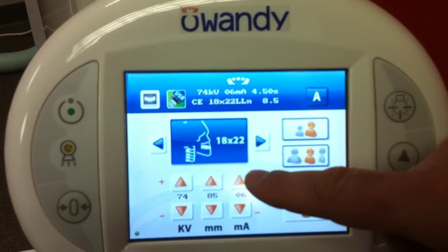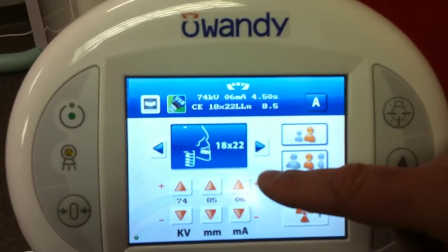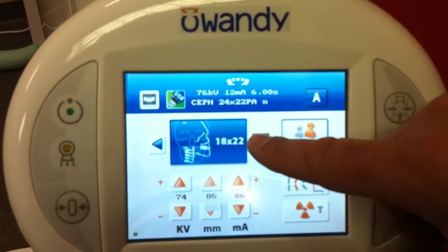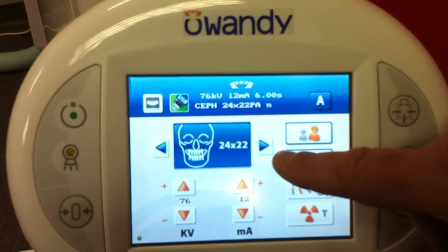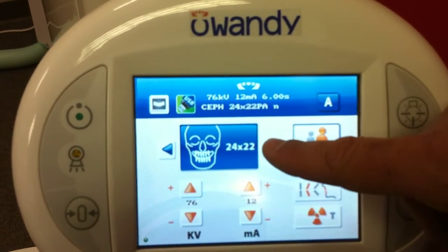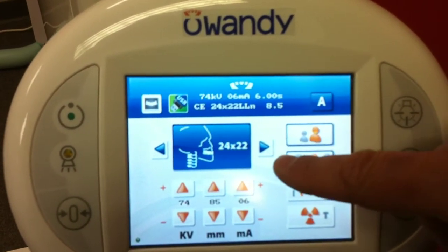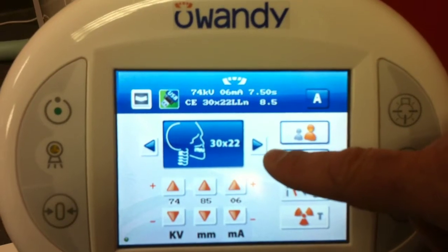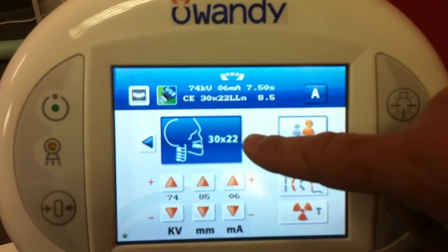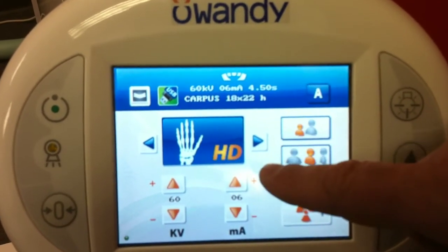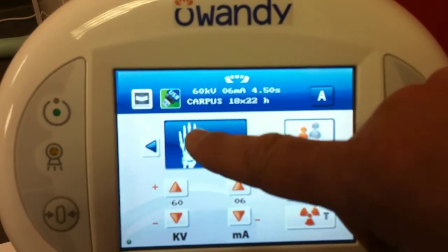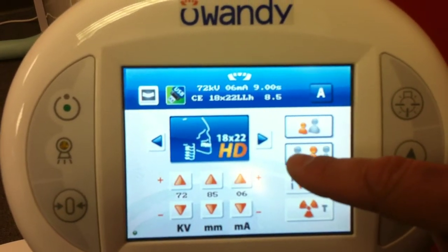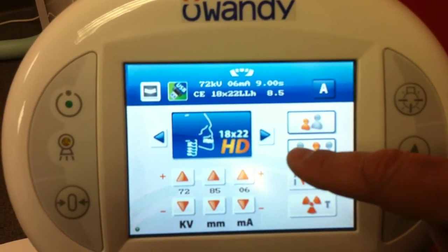From there we go to the Ceph mode. You have the lateral 18x22, frontal 24x22, lateral 24x22, lateral 30x22, and the carpus. From there you go into high definition Ceph mode.